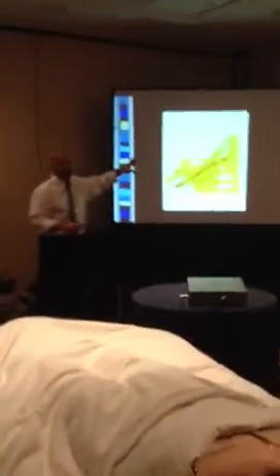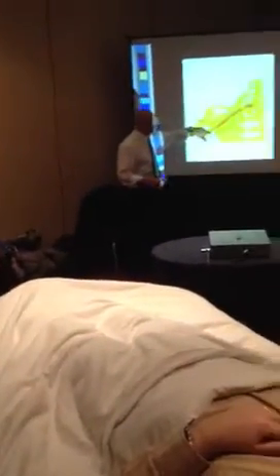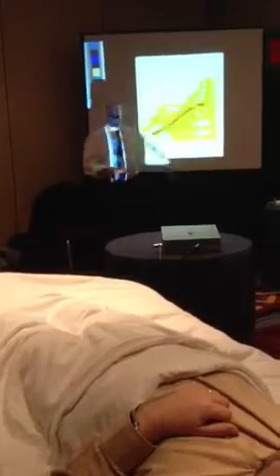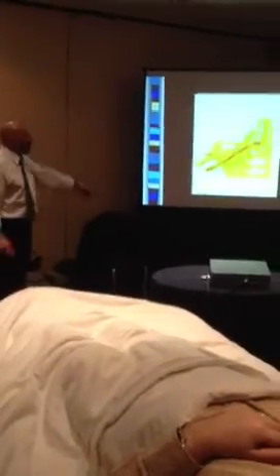So let's look at this. Now, I know this is a drawing. It has certain limitations, but whatever we can say, that if I put a needle here, 1 inch out from the midpoint of the clavicle, perpendicular to the clavicle, aiming out lateral to the pulsation of the artery, putting a needle here, aiming it here, then I'm outside of there. Yeah, okay, but David, really, that's a drawing. You can almost do anything with a drawing. I watch cartoons. I'm about 80% convinced.